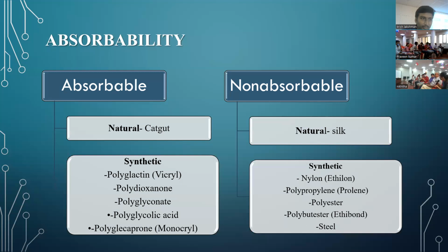So something that is absorbable is better for cosmetic, or non-absorbable? Non-absorbable sutures are better, because all your absorbable sutures tend to stay in place for as long as up to 90 days. And if you use Monocryl and all, 90 days to 120 days. So imagine if you leave a suture in place. I'm not talking about tensile strength, I'm just talking about the suture being in place. The longer they are, the thicker the scar. It looks good on day one when you don't have any sutures, but over a long period of time, if you look at cosmesis, non-absorbable are better.